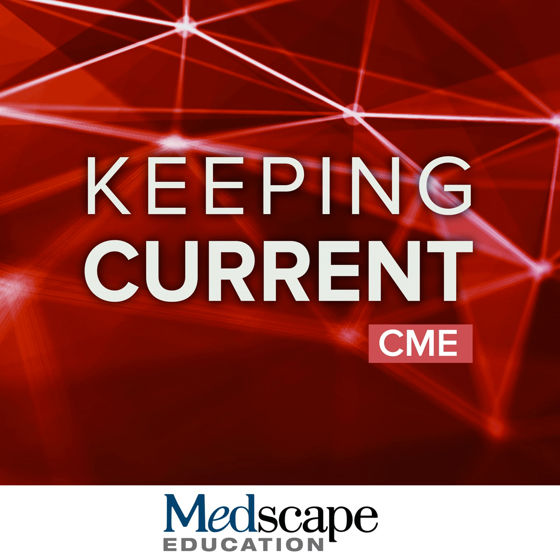So you can clearly see that this patient has a perfusion defect in the septum and the anterior wall, starting from the base, involving the mid and also the apical slice of the left ventricle. So very obviously, by qualitative perfusion, you can see that there is an ischemic focus, recognizing that he had no infarction on the LGE. Also, what's interesting with CMR is what's not immediately obvious was the inferior wall. If you look at the basal inferior wall, there is also a very small subtle perfusion defect that wasn't very easy to see.